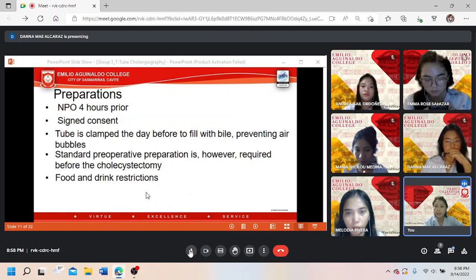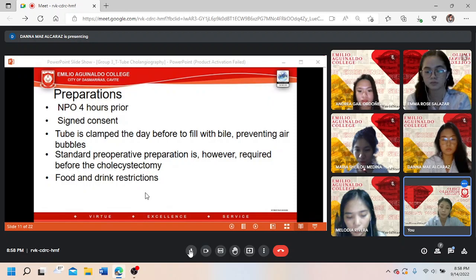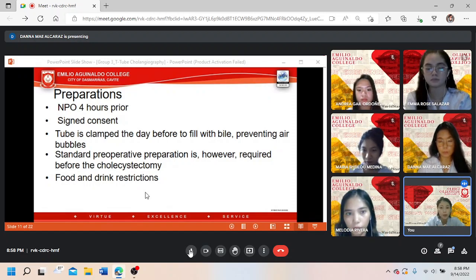So, for the preparation, NPO, 4 hours prior. What is NPO? NPO is nothing by mouth. It is used to describe a situation when the patient is expected not to eat or drink. Especially before and after the surgical procedure, they are not allowed to eat.